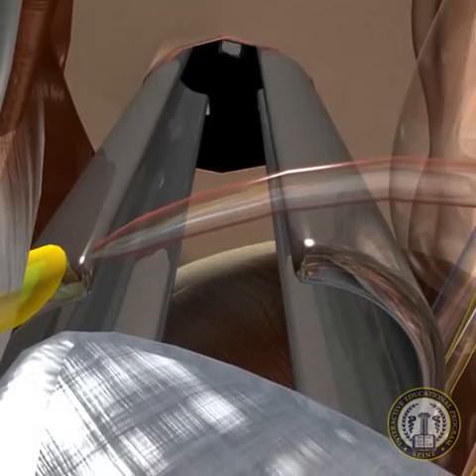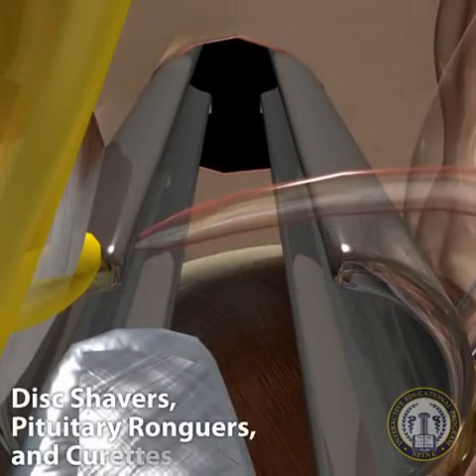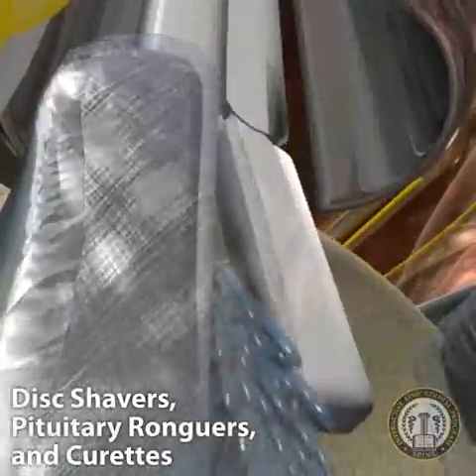A box annulotomy is then performed at the lateral annulus. A radical discectomy is completed with the use of disc shavers, pituitary rongeurs, and curettes.